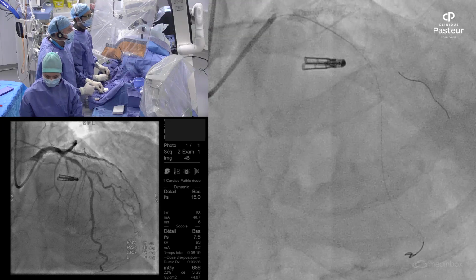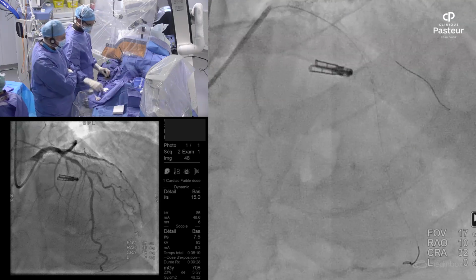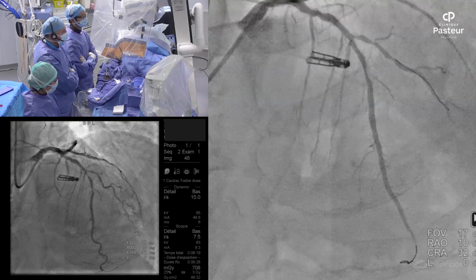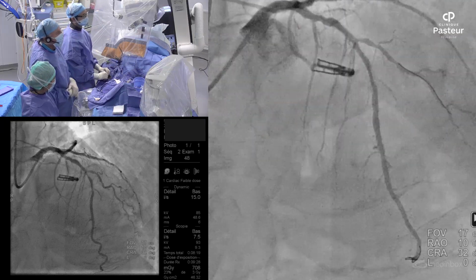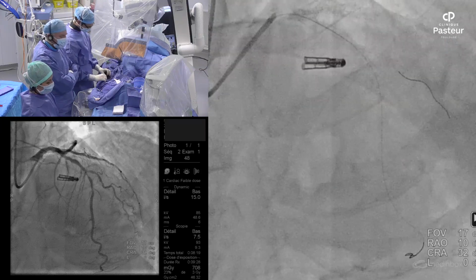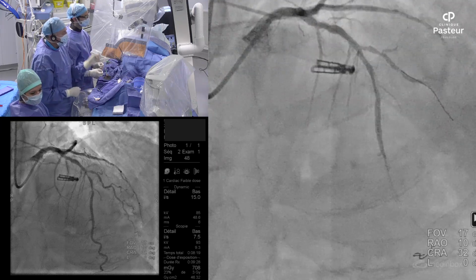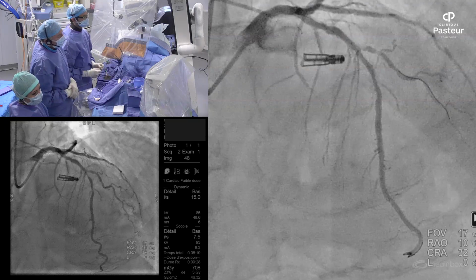On peut faire une autre angio, peut-être Bruno, je n'étais pas dans le tronc. Vas-y. For those who ask, if you put your wire and your microcatheter does not advance, it's a very unusual event, but it might happen. There is a new microcatheter that you can torque, which almost always goes. If it doesn't go, what you have to do is cross the lesion with your rota wire. Which is painful because it's difficult to control, but in most cases you will manage with a floppy rota wire. And this is the last option. Effectively, when you have difficulty crossing with the microcatheter, sometimes you put the microcatheter just in front of the lesion and you are able to cross with the rota wire. That's effectively a possibility.